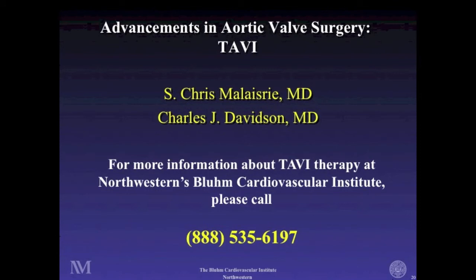And then the third thing we're looking at is, again, improvements to the actual valve technology and having better sealing of the native valve when the new valve is put in. Some of the newer devices in particular are looking at how do you seal and basically exclude the native valve from the circulation, so the potential for these late strokes may decline as well.